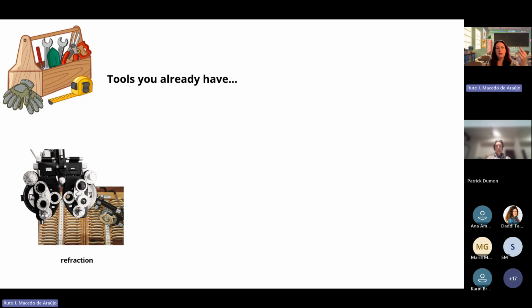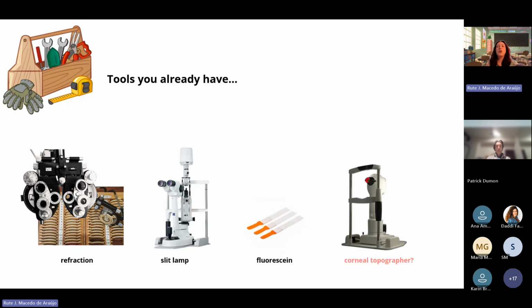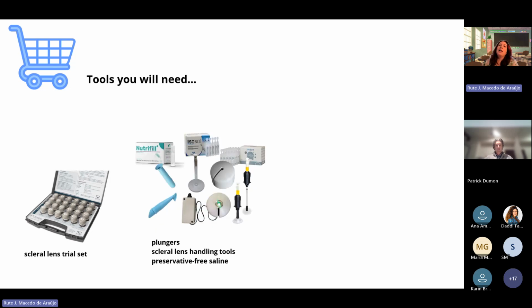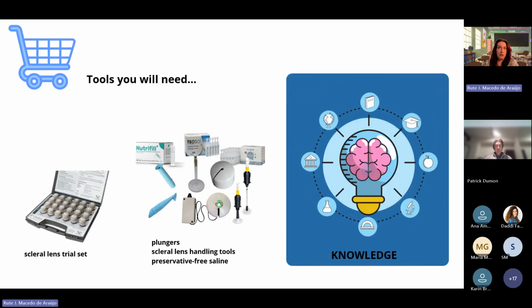So refraction tools, slit lamp, fluorescein. A corneal topographer is not essential, but we will see that it can help a little bit in some cases, but we can remove the corneal topographer from here. And if you are not a scleral lens fitter, you will need to have some more things. Of course, trial sets, plungers or other scleral lens handling tools, preservative-free saline solutions, and the most important, knowledge.